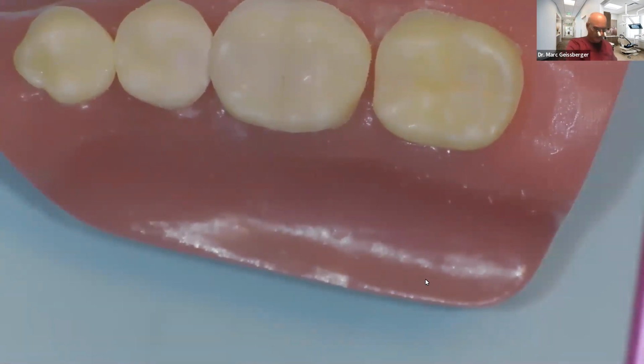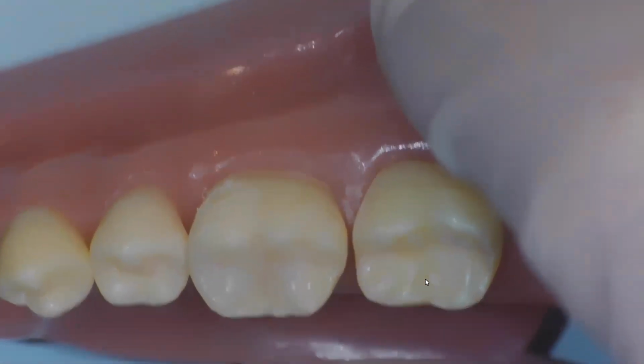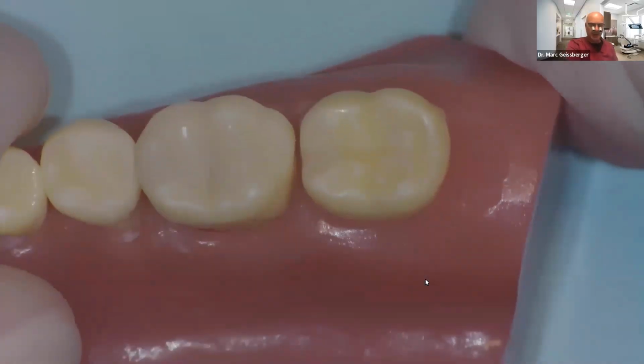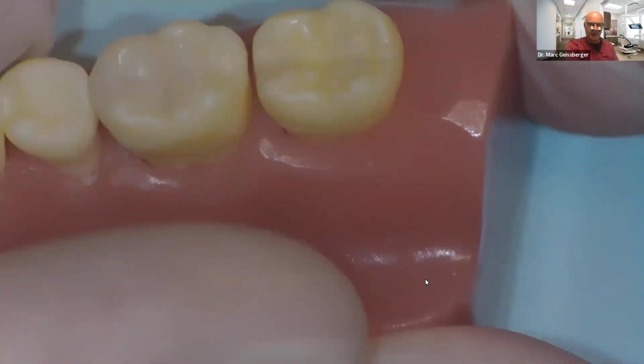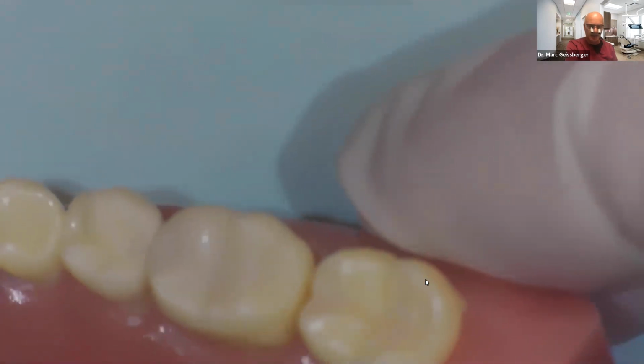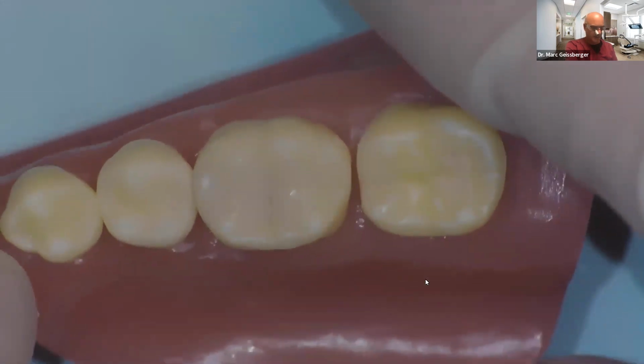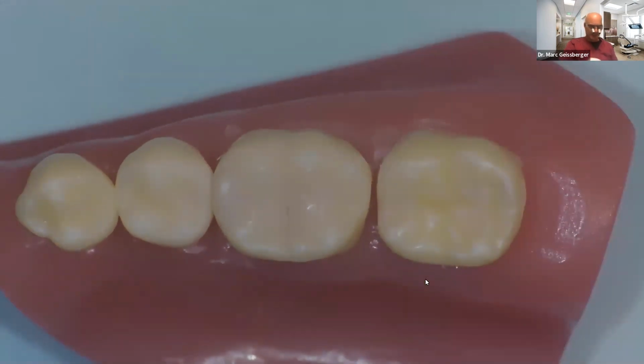Okay, so now what I'm going to do is just roll this around, and you can see that we've got, now this is the most important, right there. Can you see that I've maintained the anatomy with those polishers? There's a good example of that high luster coming off that triangular ridge. So with that said, that's it for tonight, but I'm going to continue answering a few questions because I've got a couple minutes.